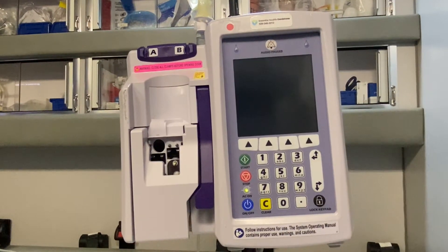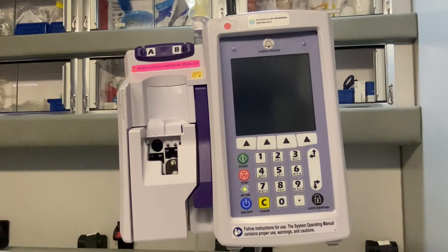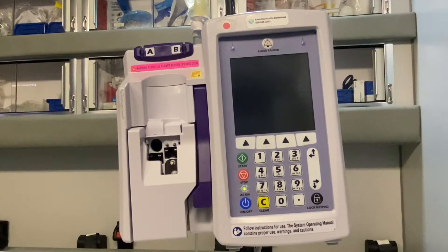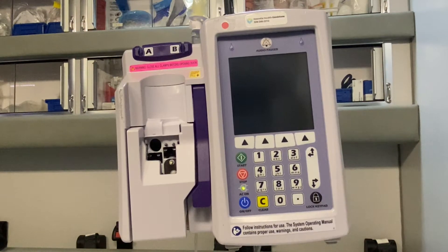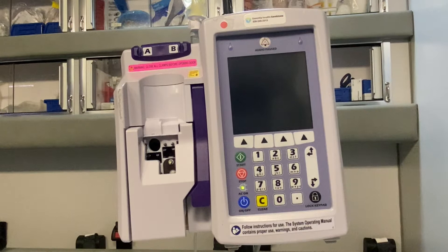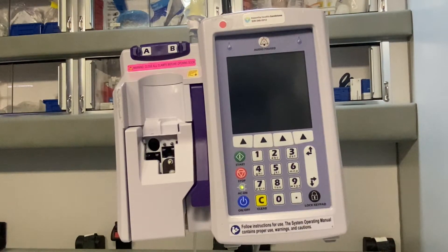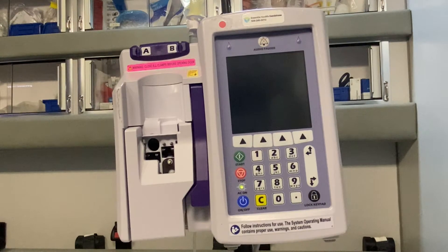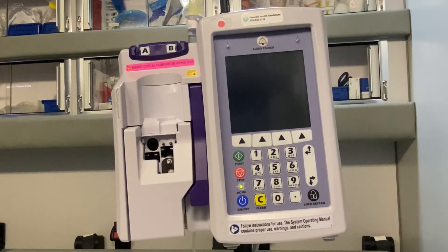Hi everyone. I'm here to show you the Plum 360 IV Infusion Pump. This pump may be different than what you use at your agency or hospital — this one is specific to Essentia Health in Minnesota. So make sure you check your pump for brand, manufacturer, and recommendations. Make sure you're in adherence with protocols and know who in your agency or facility is the pump expert that can help you with any troubleshooting.